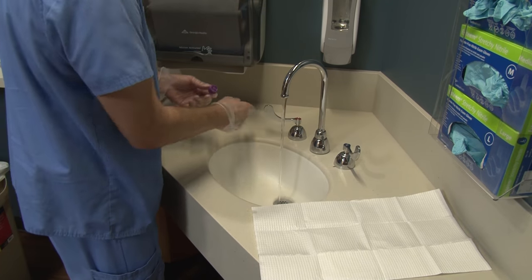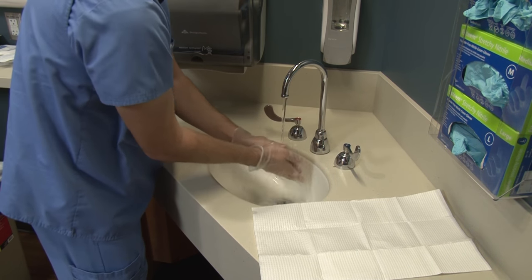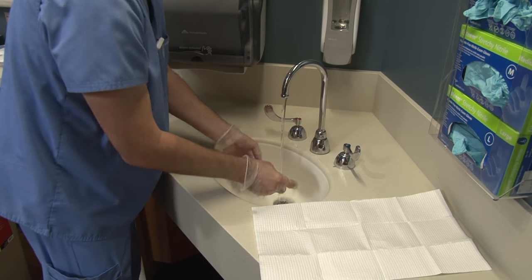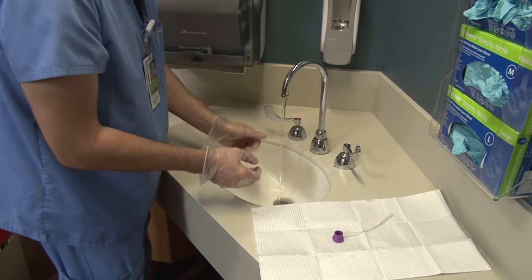The speaking valve is easy to care for. Wash it with warm soapy water when it is dirty and pat dry or leave it out to dry. Make sure to talk to your speech therapist if you have any problems.